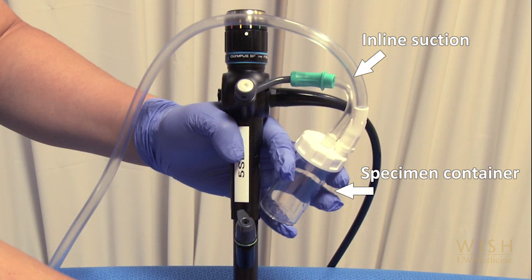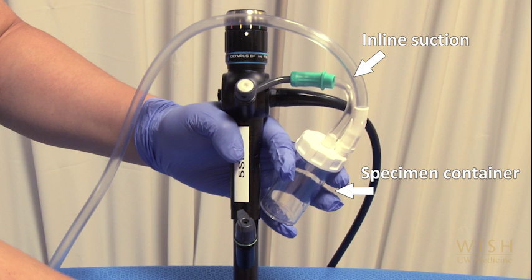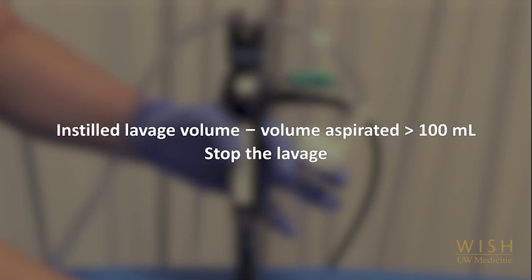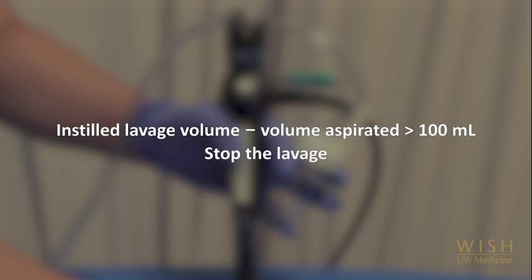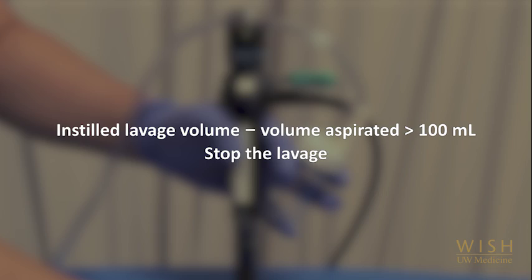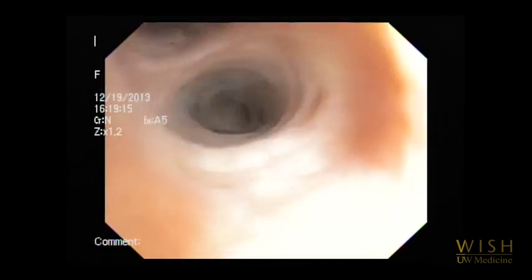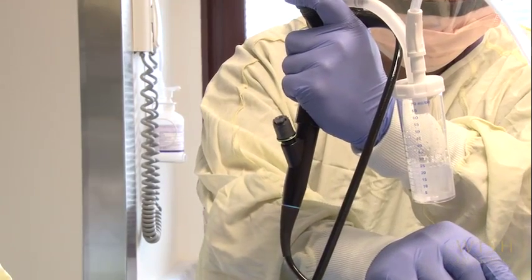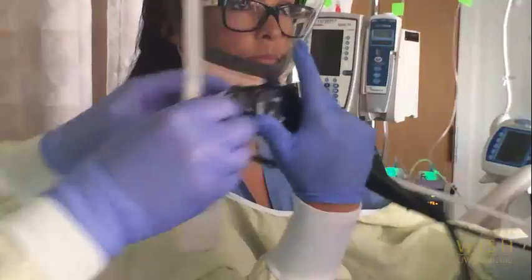Next, a sterile specimen container, commonly referred to as a Lukens trap, is attached in-line with the suction tubing to the bronchoscope. The lavage fluid is retrieved by suctioning through the bronchoscope into the specimen container. If the difference between the instilled lavage volume and the volume aspirated is greater than 100 milliliters, it is preferable to stop lavage in that particular segment. Generally, 10 to 25 milliliters of lavage volume is sufficient for routine bacterial and fungal cultures; however, larger volumes may be required depending upon the specific tests to be run.